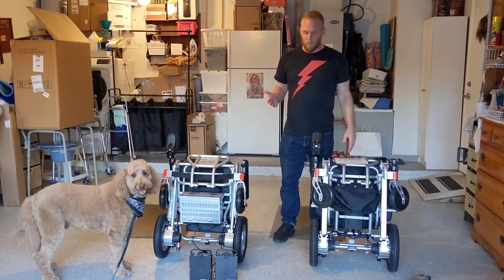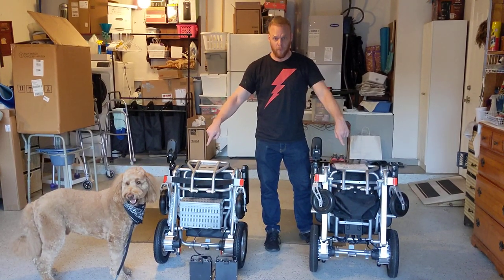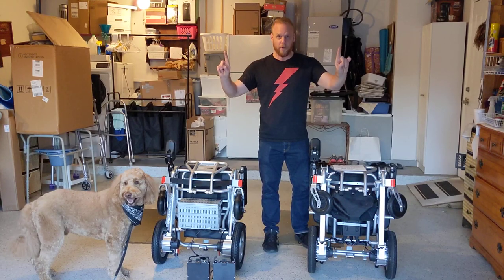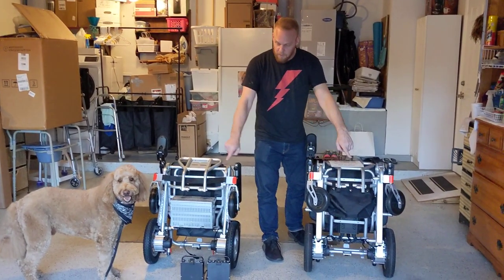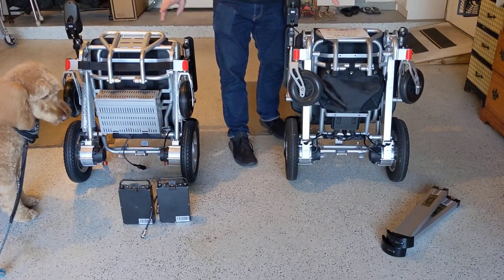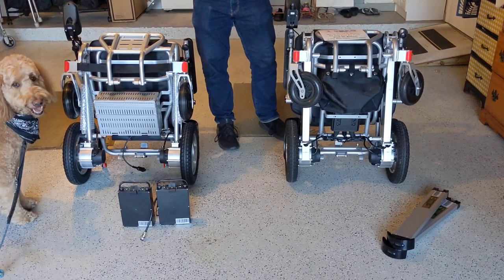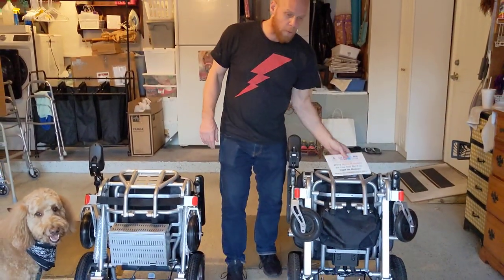Hello, this is Paul from QuickenMobile.com. Right now I have two power folding wheelchairs here that are similar but have one major difference and some other differences as well. You'll see in the front of the chairs we have their batteries. This is a comparison video — we're going to demonstrate how easy it is to unfold each of these chairs, put the batteries in, and then take the batteries out.